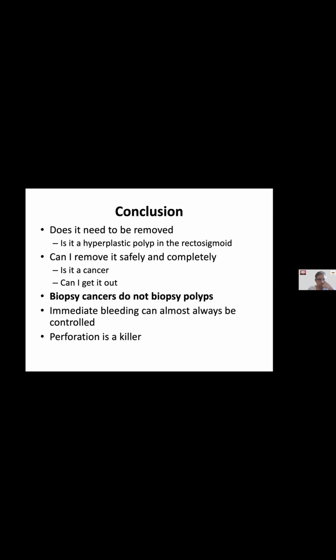And can you get it out? Are you the person to get it out? Please biopsy cancers by all means, but do not biopsy polyps. Clearly there's a group of patients where you're in between and you're not sure, but flat lesions, if you biopsy a flat lesion, the person is going to end up probably having surgery for even a relatively small polyp because it won't lift later. Immediate bleeding can almost always be controlled, and perforation really is a killer, and it is really not acceptable as a complication, I think.